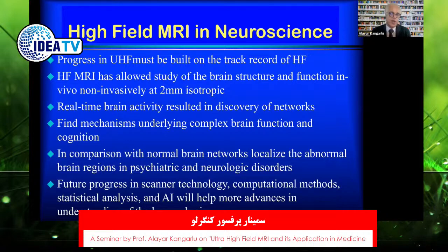So using hyperpolarized carbon-13, hyperpolarized other elements, helium, for instance: one of the deficiencies of MRI is that it doesn't produce good lung images, because the large cavity of the lung introduces a very high susceptibility, and the absence of high concentration of the hydrogen containing elements in the lung doesn't really produce very good images.